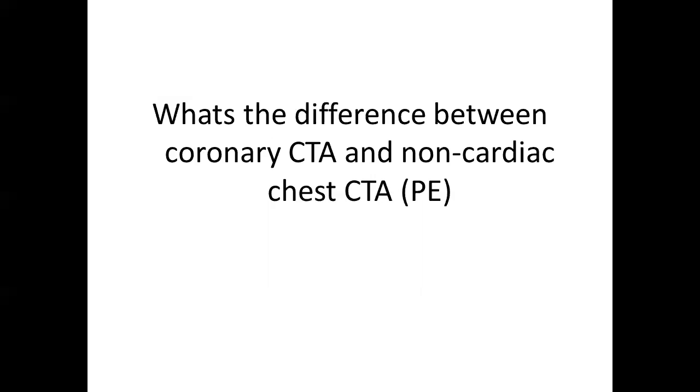Okay, yeah. Heart rate. So yes, we will control the heart rate for a coronary CT, and by that, what you're doing is increasing the temporal resolution by slowing down the heart rate. And last thing, small thing, is we give nitroglycerin for coronary CTs to vasodilate the coronaries. So once in a while, when you can see the coronaries on a PE, where the timing just happened to be such that there is contrast there, the vessels still look pretty small because they haven't got a nitro, whereas on a coronary CT, they look much bigger because we give nitro.